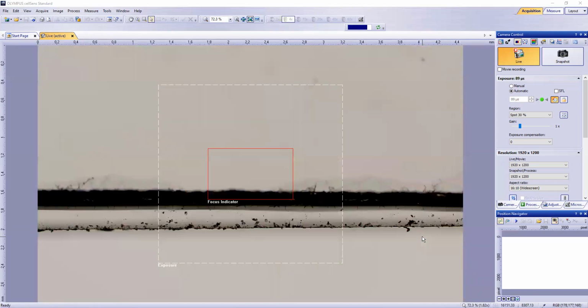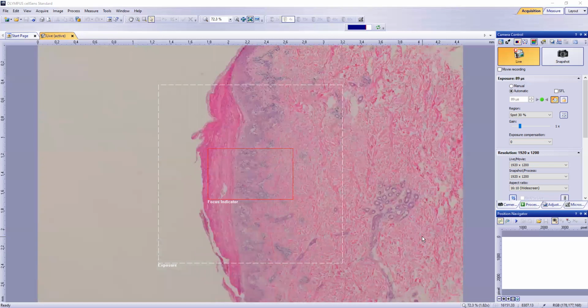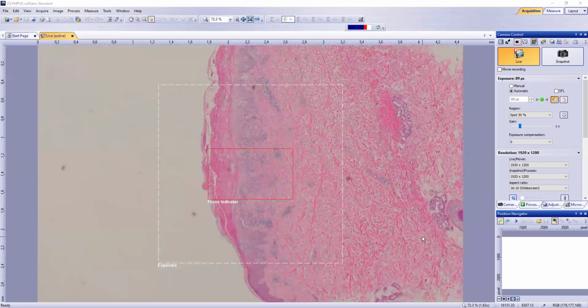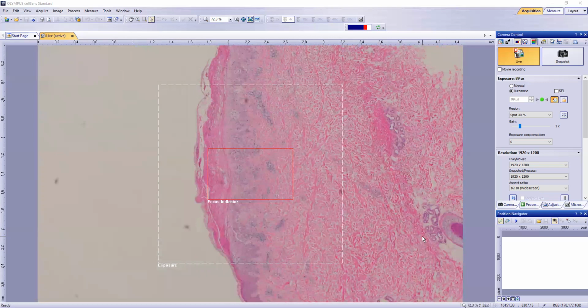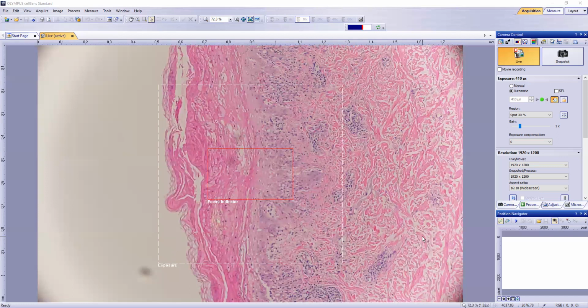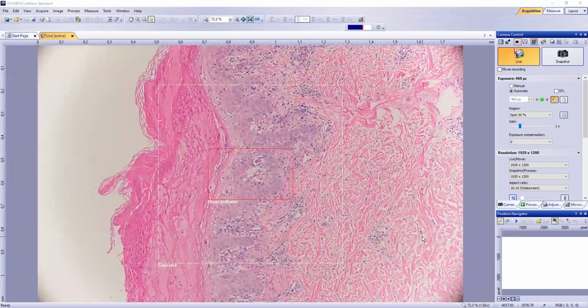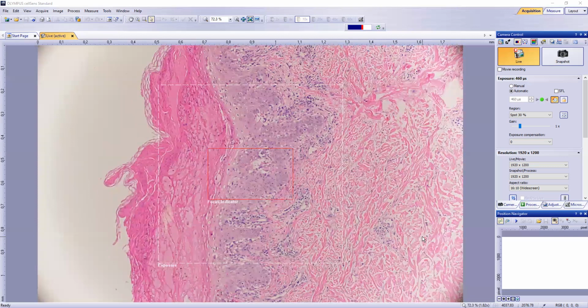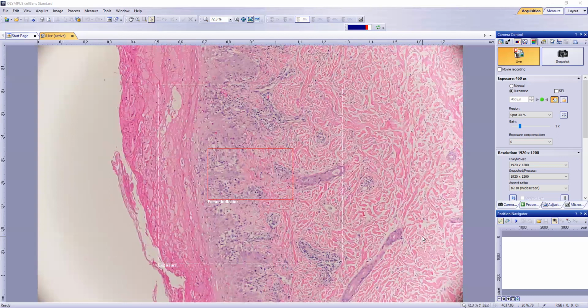So in PLEVA, you tend to have focal or confluent parakeratosis. You can see here that we have this huge mound of parakeratosis up high in the stratum corneum. And usually those zones of parakeratosis will have some serum in them. That frothy pale pink stuff is all serum. And concomitant with that, you'll see neutrophils too. You'll see neutrophils in that scale crust. So that's a very common feature of PLEVA.